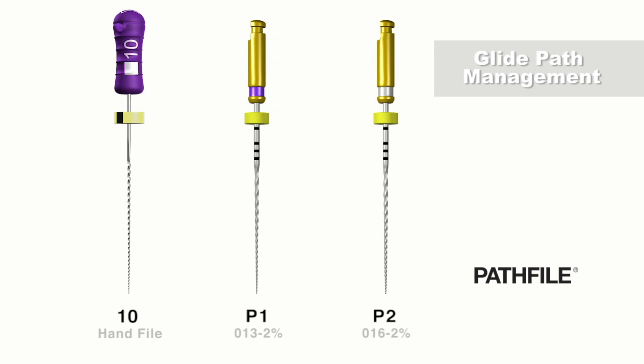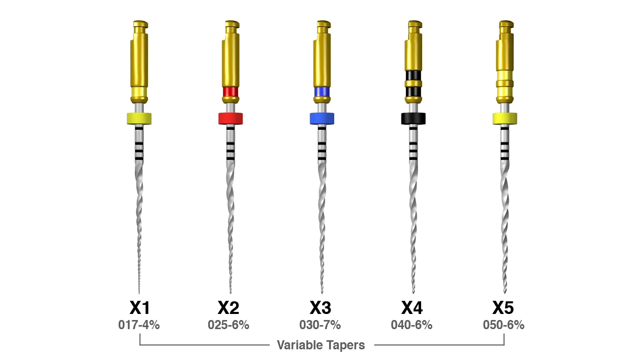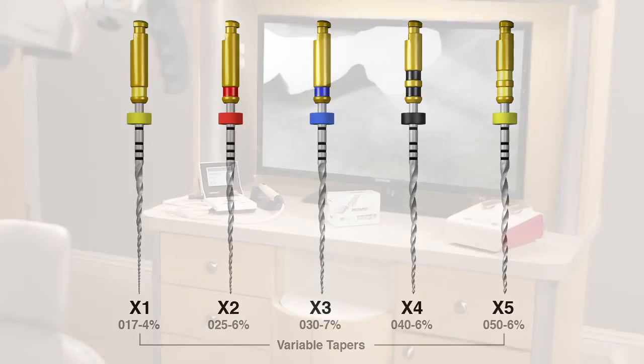Perhaps the most important procedure in endodontics today is to find, negotiate, and secure canals to their full working length. Fortuitously, manually secured canals can be safely and efficiently enlarged with dedicated mechanical glide path files. The ProTaper Next family of instruments is comprised of 5 files. They are designed to work in sequence where each file progressively enlarges the canal towards the final desired shape. This is ProTaper Next.